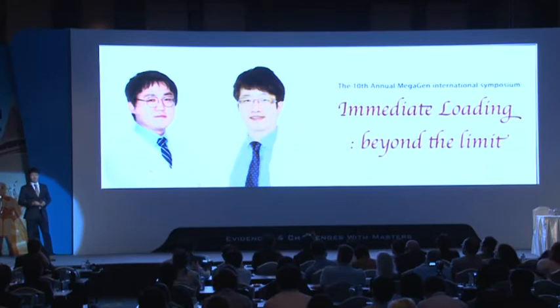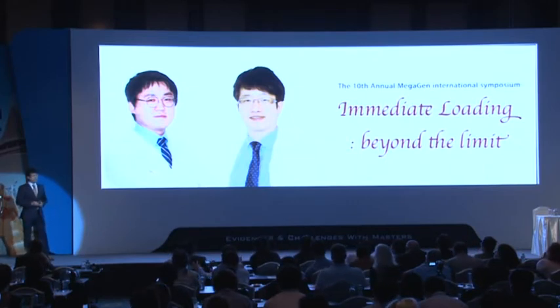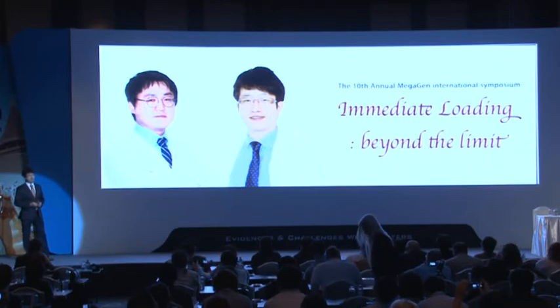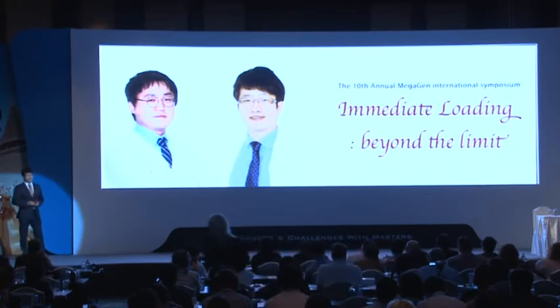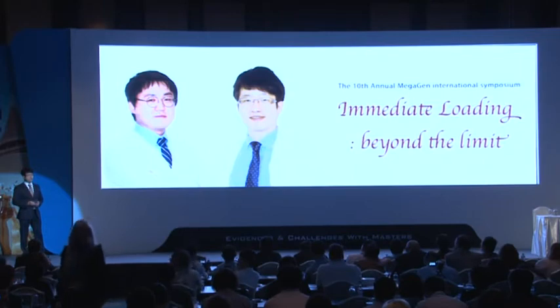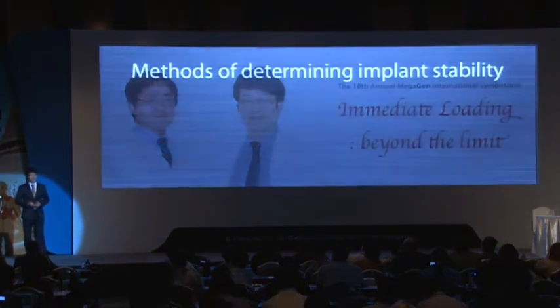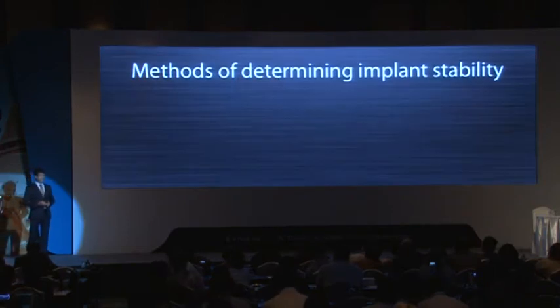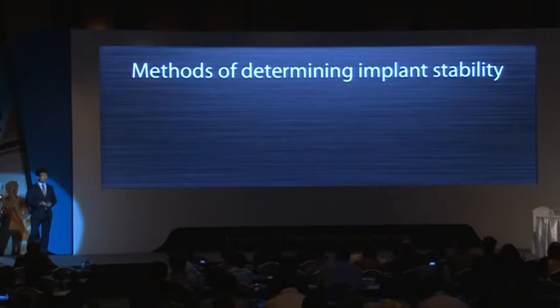Patients today want the final result sooner rather than later. And the main issues of implant dentistry these days are focusing on the reduction of the initial healing period. So we have to know the changes of implant stability in the initial healing phase. But there are few objective methods to evaluate implant stability. The most common, simplest, and probably most inaccurate test was the percussion test.